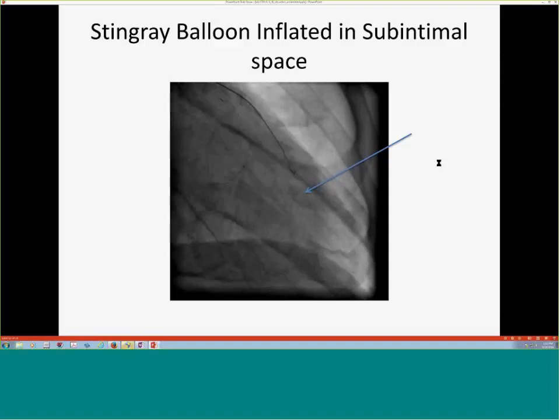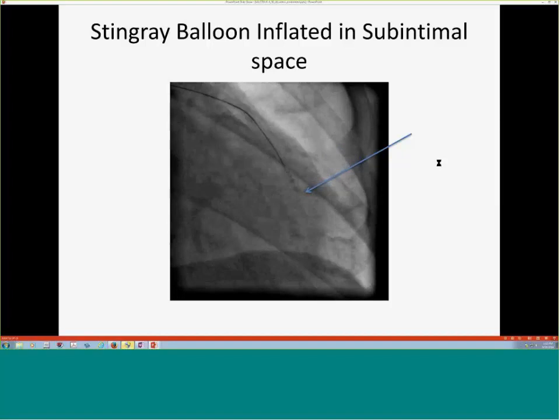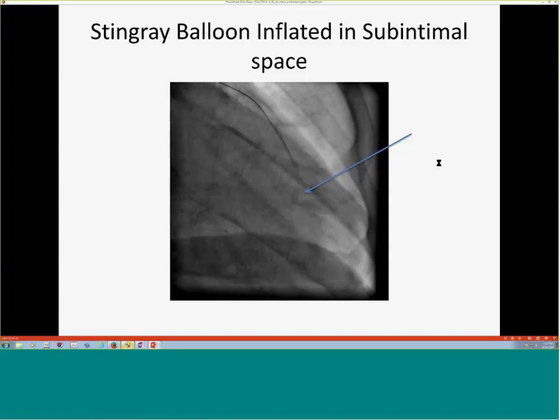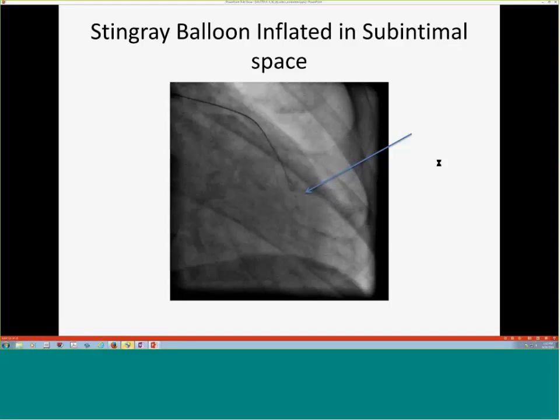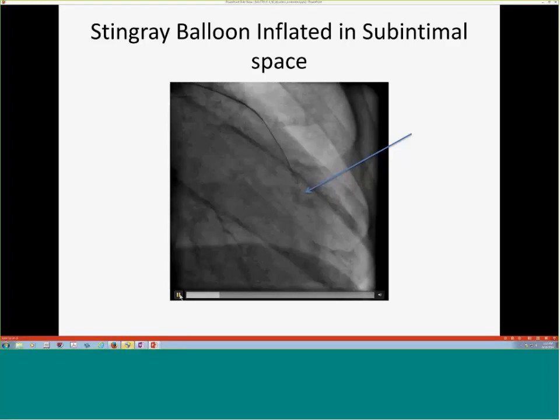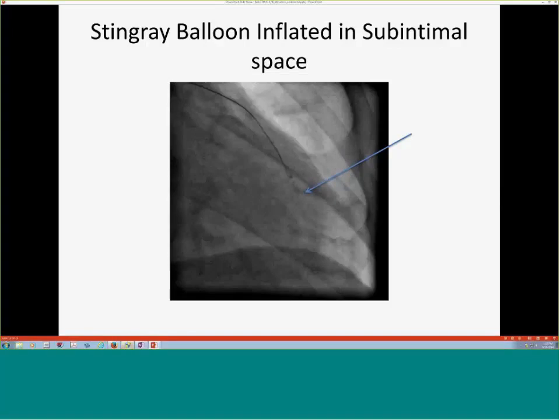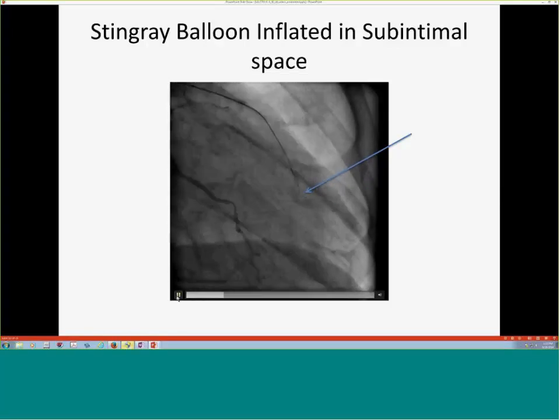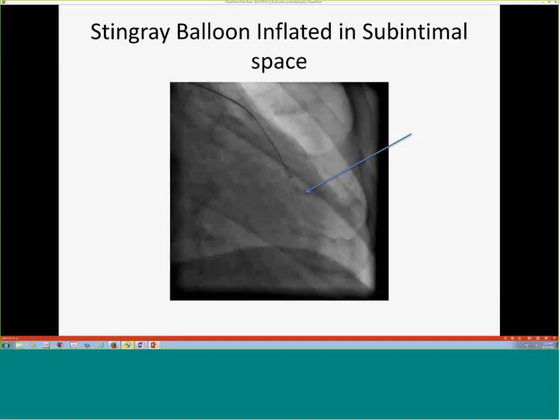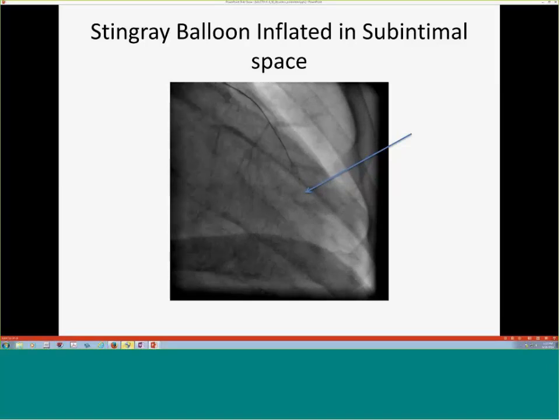So what I thought was going on here, my subintimal hematoma was expanding, and this is relatively common, but sometimes you are really now trying to access a vessel that you don't see very well. And I was unable to regain access to the true lumen. And I think this is a fairly common problem in my experience. I don't know what you think, Manos, where you position yourself for success, and then 5-10 minutes later, you realize that you don't see the distal bed as well anymore.